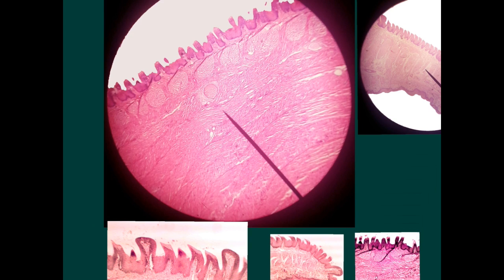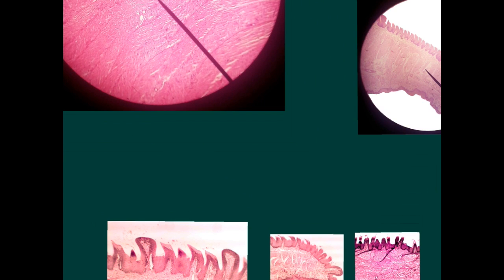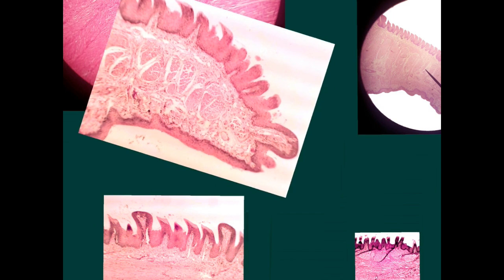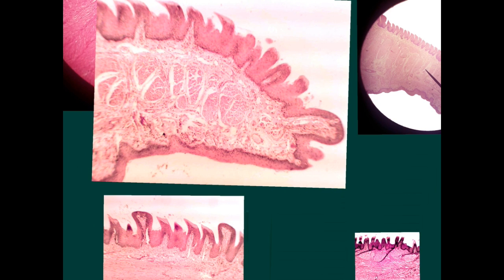as you see. And then you will move the slide also to show the undersurface. Here it is formed of this smooth surface of mucous membrane, and these are the papillae, of course, filiform papillae, fungiform papillae, and these are the muscle tissue.